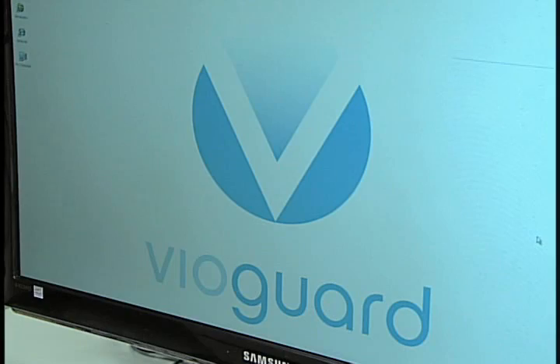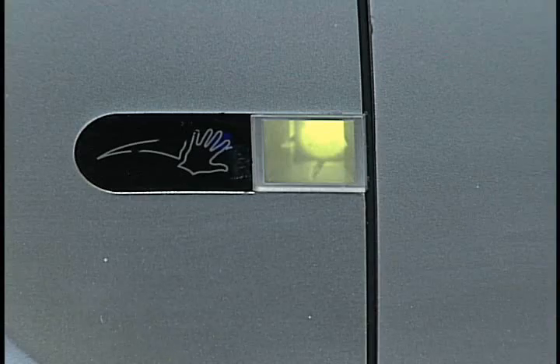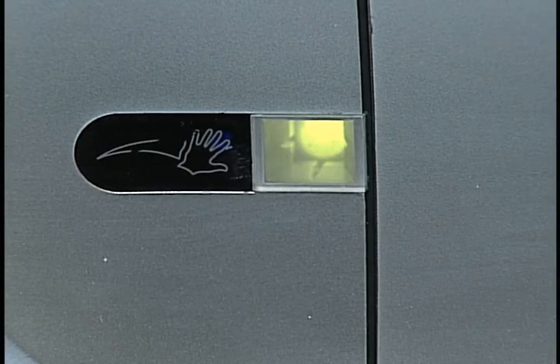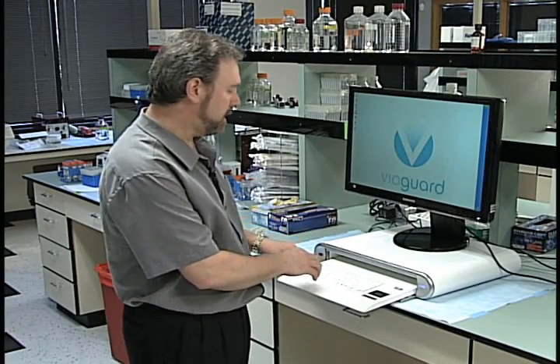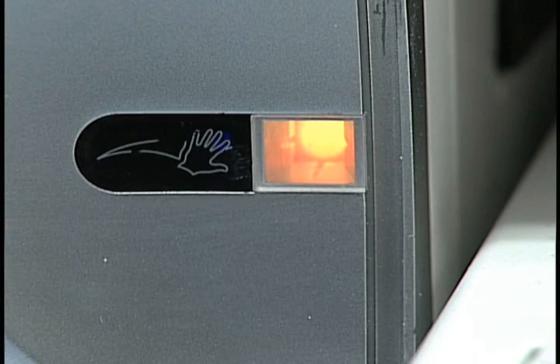The unit is intelligent enough to determine whether or not the keyboard has actually been touched. The light's green right now, indicating that the keyboard has gone through its cycle. Once you touch the keyboard or the touchpad, the indicator will turn orange. The unit knows now that it's potentially contaminated.